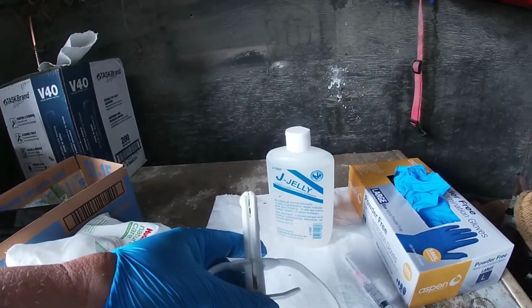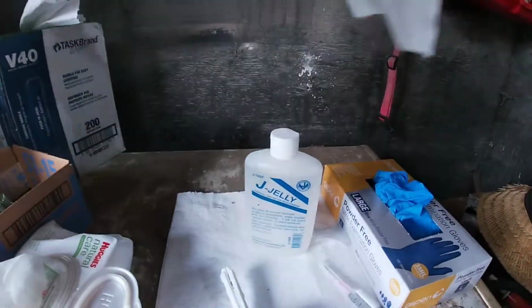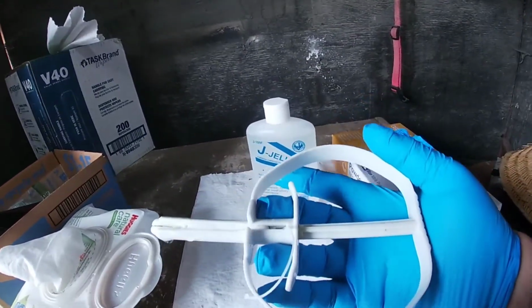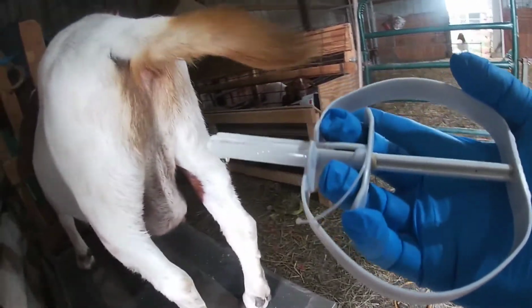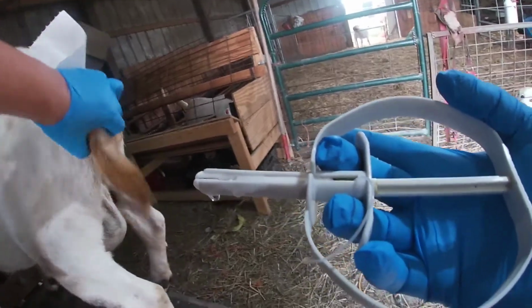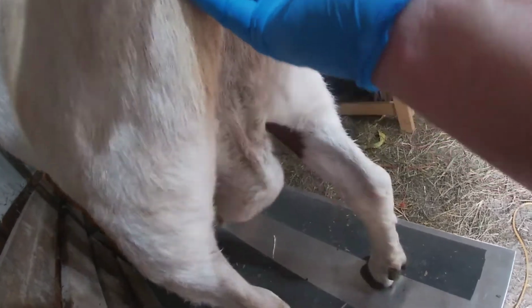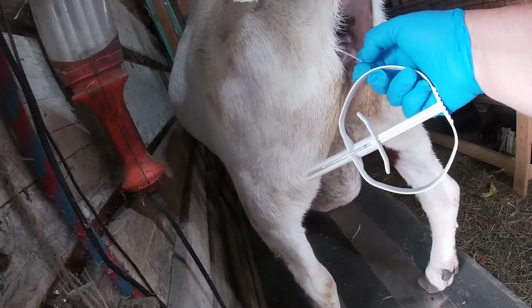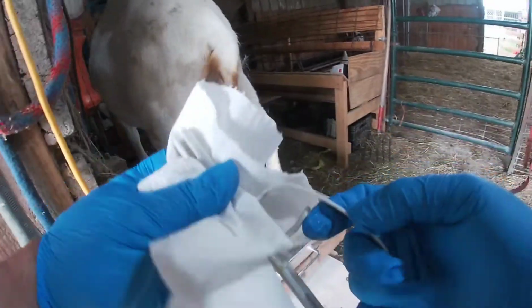So this is how you do it. I got all kinds of stuff over here. So, all right, you hold it like so, and she's kind of high up on the stand, and she's not going to like this very much. Grab her tail. You're going to go at an upward angle, and well, I guess evidently it's in there. So you'll see this little string right here. That's where we pull it out later, but it's going to stay in there for 6 days.